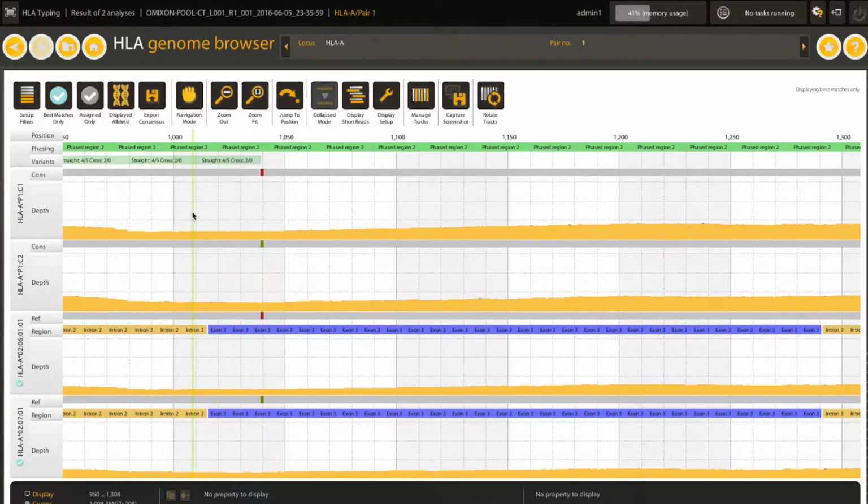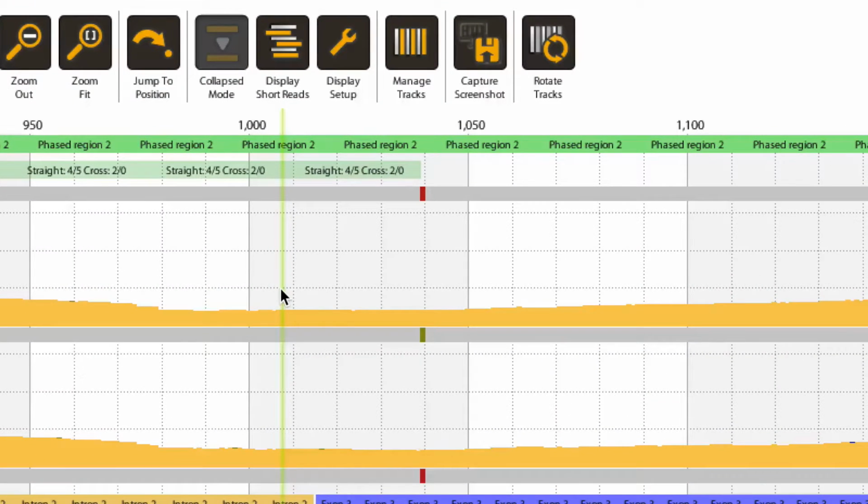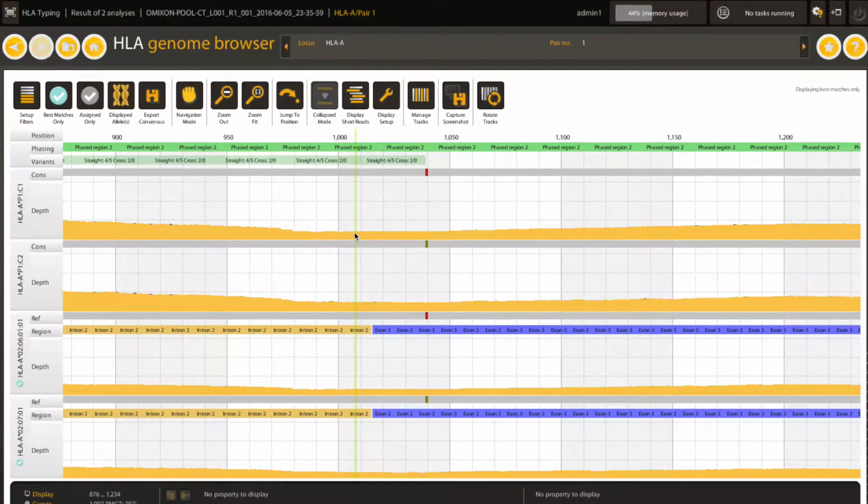The library preparation is targeting fragments of 1000 to 1300 base pairs in size. However, these are substantially trimmed after the sequencing. The primers and the adapters are removed and sequences are also trimmed based on quality. The average fragment size will be about 450 base pairs, with a range of fragments smaller and larger than this, but with a maximum of around 1000 base pairs.